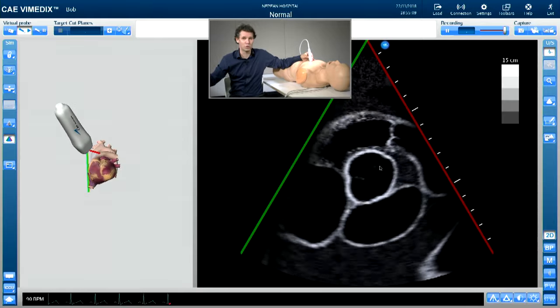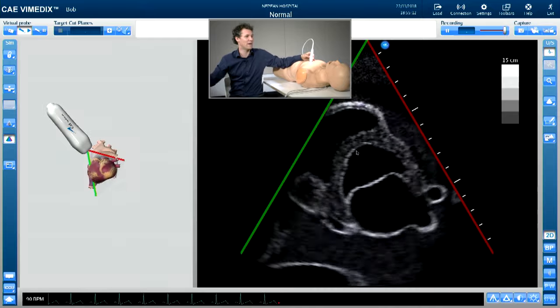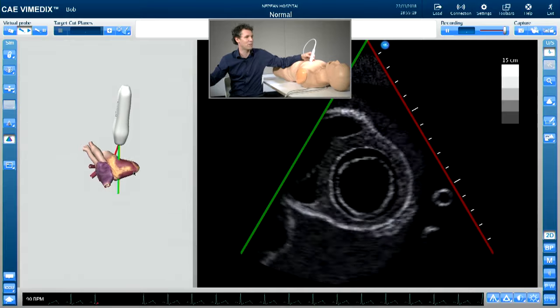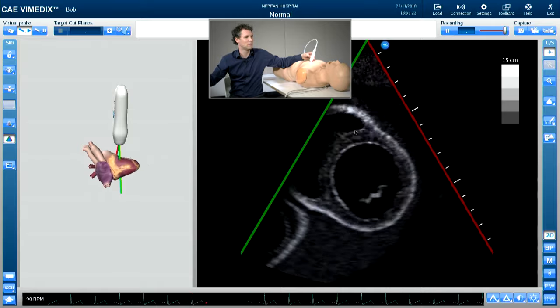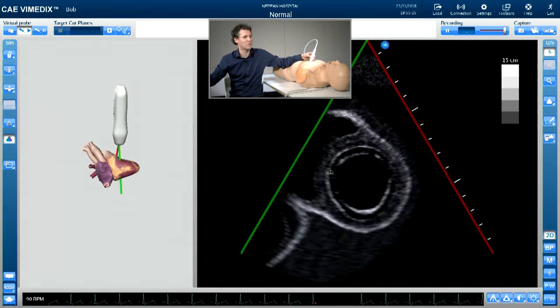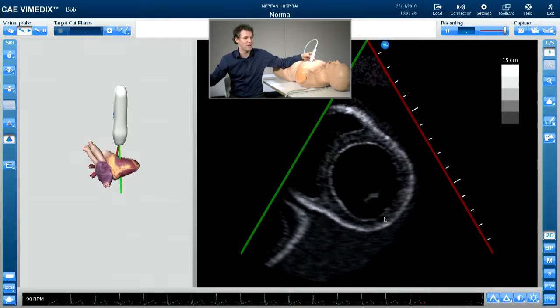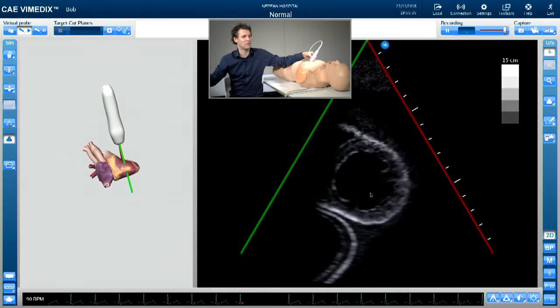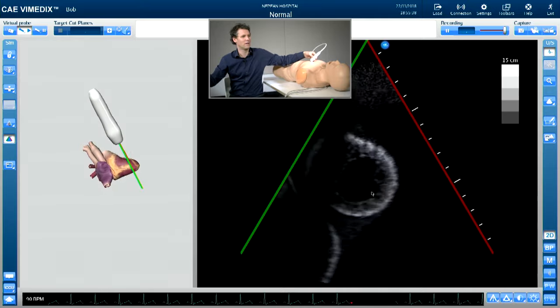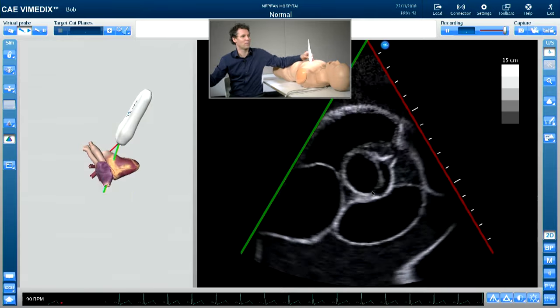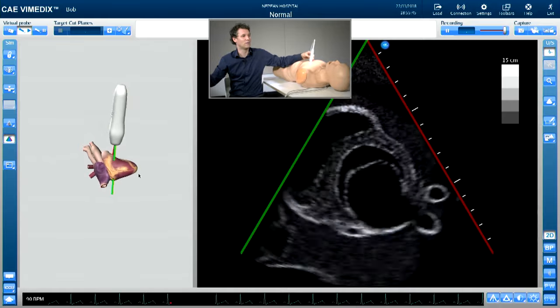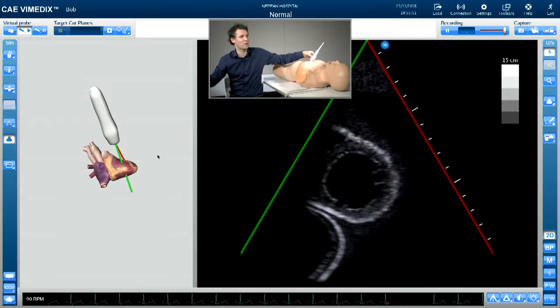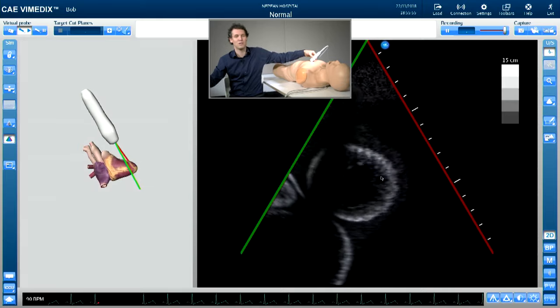After finishing with the short axis view at the level of the aortic valve, we can then fan down from the aortic valve level through to the base of the heart at the mitral valve level - with the anterior wall, inferior wall, anterior septal, inferoseptal, anterolateral, inferolateral segments - down to the mid-papillary level where you can see the papillary muscles, and right the way down to the apex. We know it's the apex because we lose the papillary muscles.